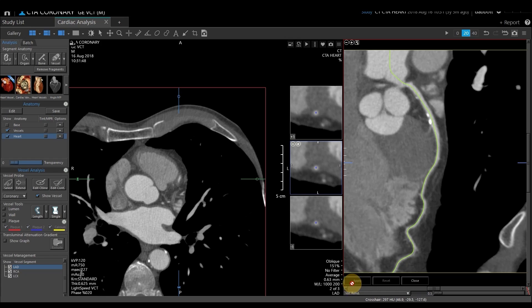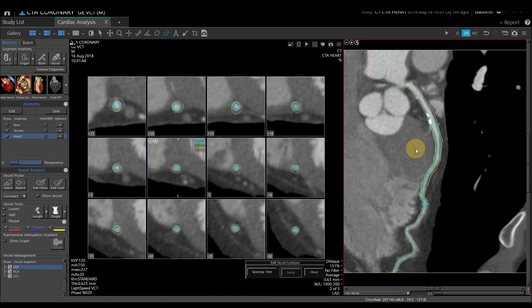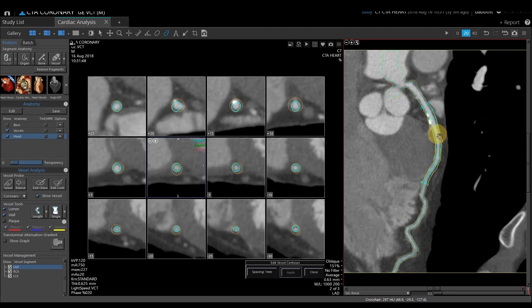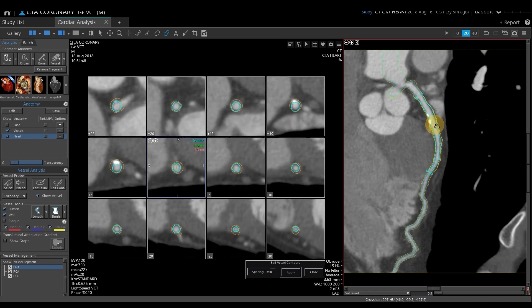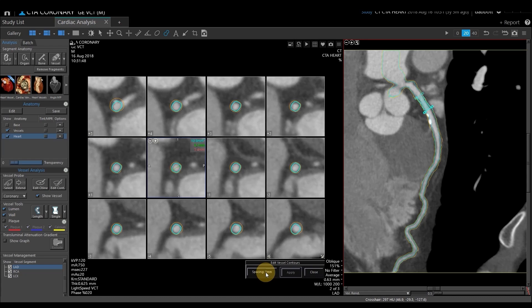The next thing I need to do for vessel analysis is right-click and edit the contours, which is our second option. This gives us a bunch of transaxial slices and contours that have been pre-selected. I have what I call a little slinky on my curved planar reformat and I can left-click and drag it above and below as needed. These are big gaps — each space corresponds to a slice on the left-hand side. I don't need that big of an area, so I'm going to change my spacing to one millimeter.